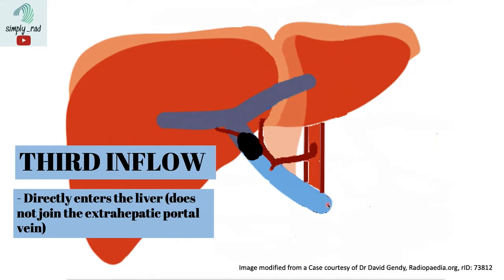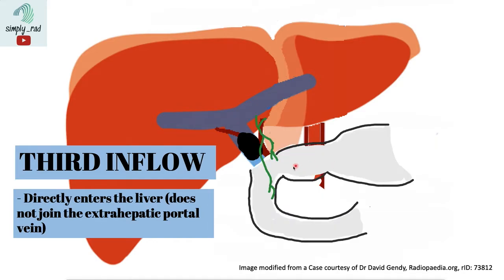A second example is when there is a block in the portal vein. When this happens, blood from the gut needs to find a way to get into the liver. Third inflow vessels draining the pylorus and duodenum would allow blood to reach the liver by bypassing this obstruction. This is what we call the cavernous transformation of the portal vein, seen in portal vein thrombosis.